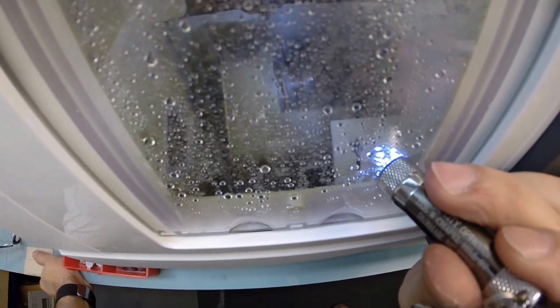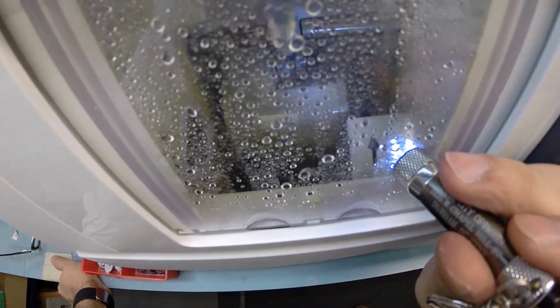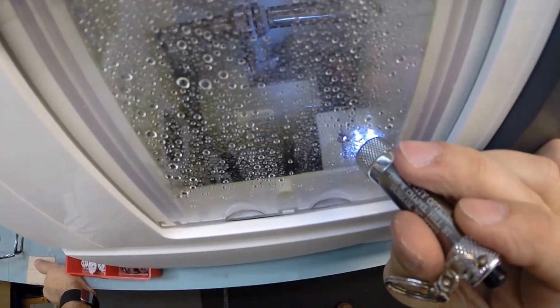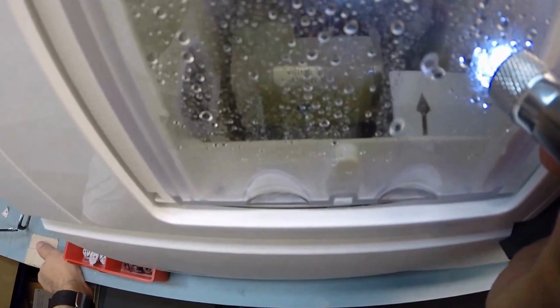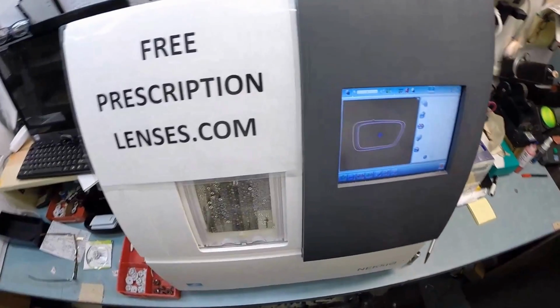Now the safety bevel again is going to be applied to the back surface of the lens. It does this every time as part of the cutting cycle. This is just a follow-up procedure anytime the lens is resized. So that is done.